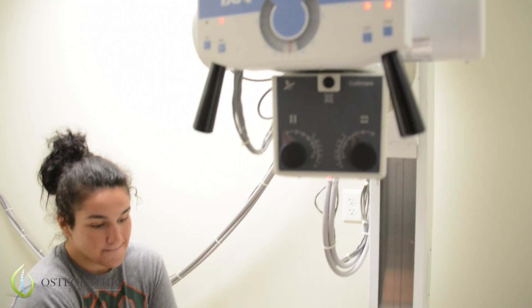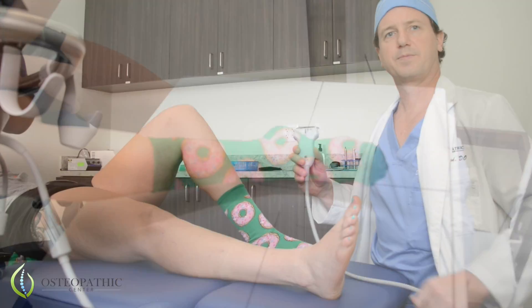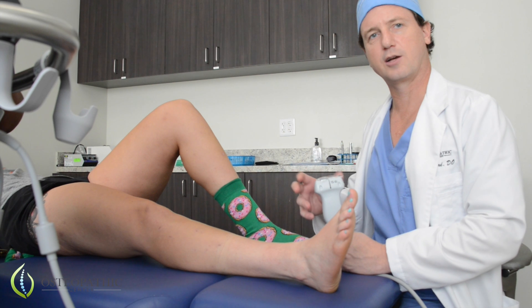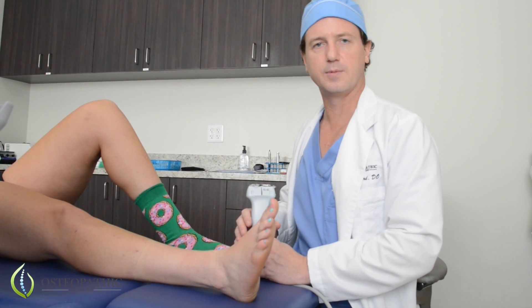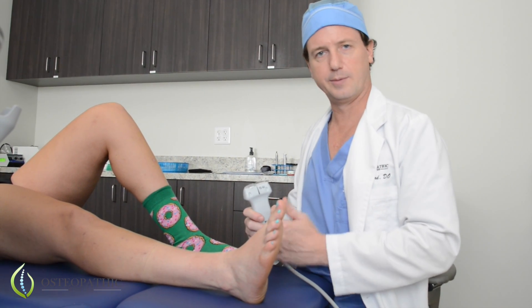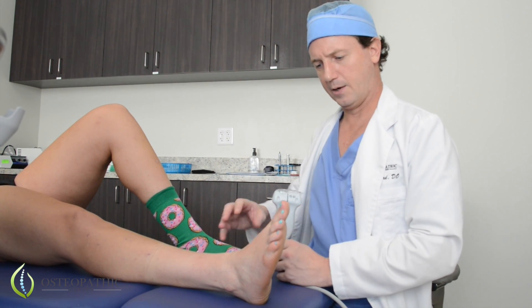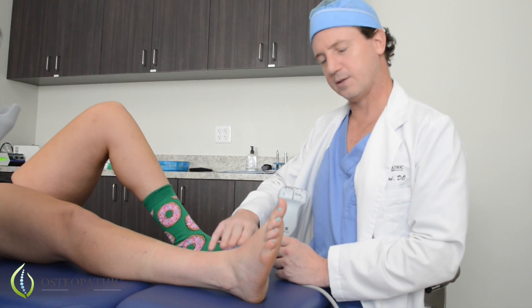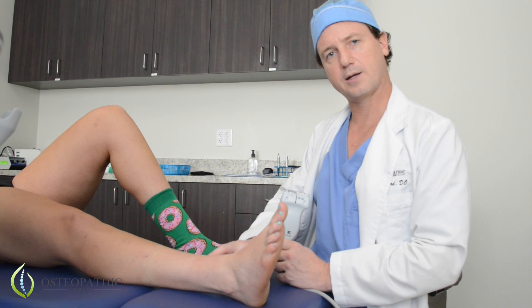Today we're evaluating an athlete who had a twisting injury of the ankle approximately one month ago, has been to PT with limited success. We're here today to look at it with imaging. X-rays were normal and we're going to look at ultrasound now. There is some point tenderness in the ligaments of the ankle, but the actual pain giving her the most problems is starting slightly above the calcaneus.